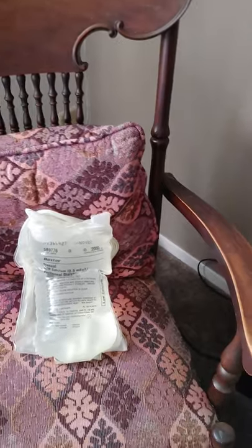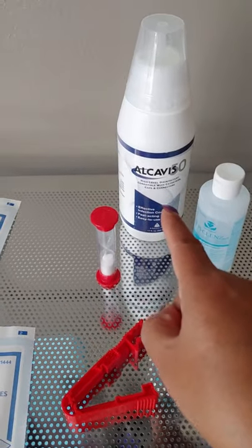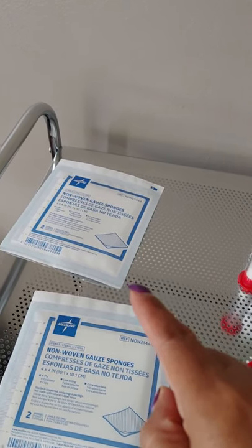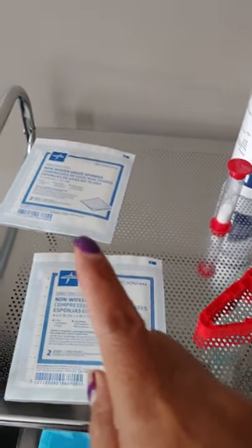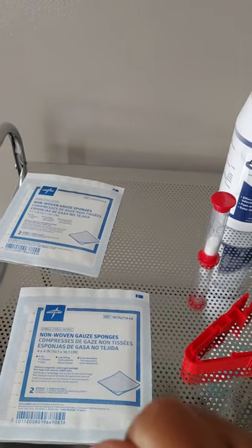You want it really dry, and then you connect to that. At the end you're doing the same thing again: opening that up, getting it disinfected, flipping your timer, scrubbing your catheter, and once it's scrubbed you dry it again. During the drying process, I actually hold onto my catheter — it's still connected to the bag — and I'll show you. So this other part is where it's going to be on my body.